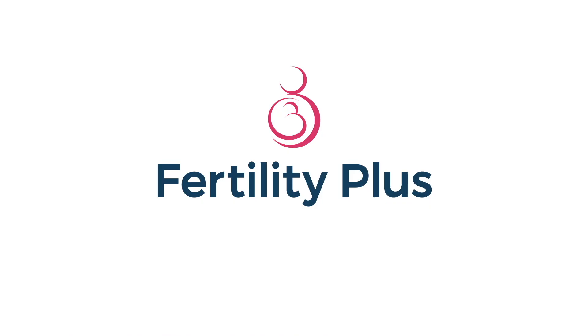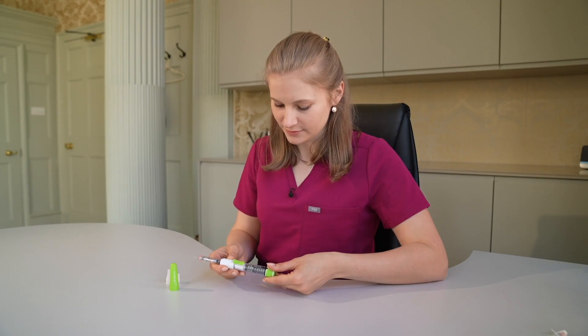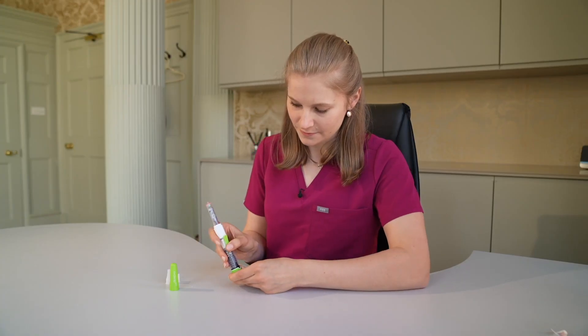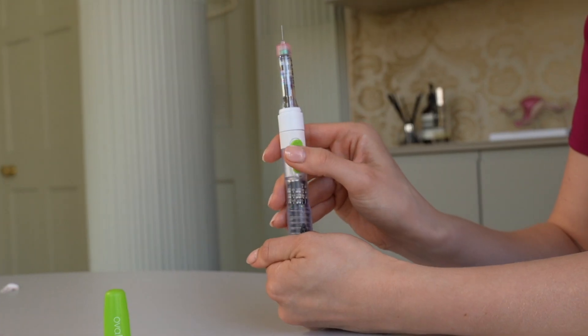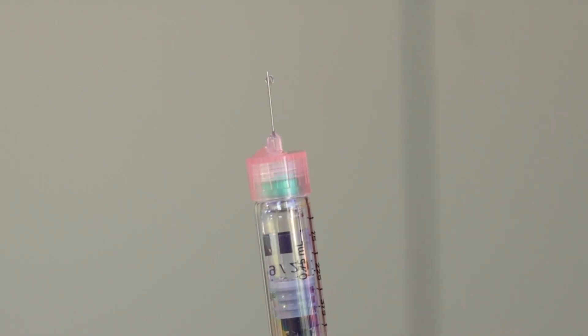The first thing we need to do is prime the needle to get rid of any excess air. This only needs to be done each time a new medication vial is used. To do this, turn the dosing dial by two clicks. Hold the pen with the needle pointing upwards and slide the injection button in the direction of the needle. A drop will form at the tip of the needle.